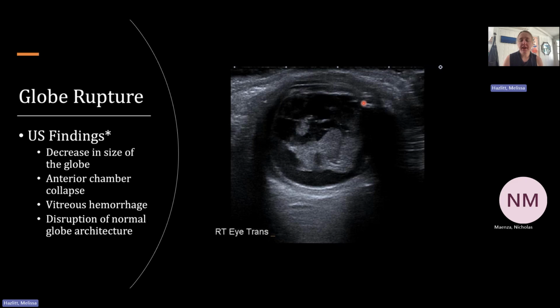But if you use cold gel, that tends to pile up easier. When you warm the gel, it gets liquidy and oozes off of the person. So if you use cold gel, you can stack it up higher and make sure that you're not increasing any pressures. When you think about examining a patient, a lot of times you'll be touching in that area as well. So if you're very careful and you don't have access to other imaging, or it's time sensitive that you find this diagnosis, just be aware of the potential risks and tread very lightly, literally and figuratively. So what do we see?